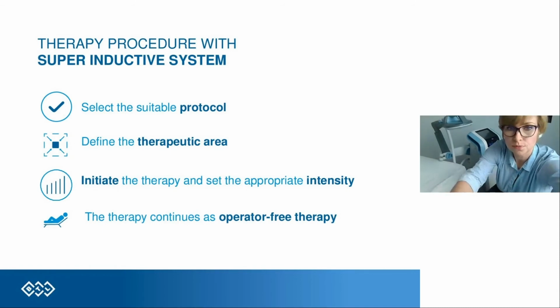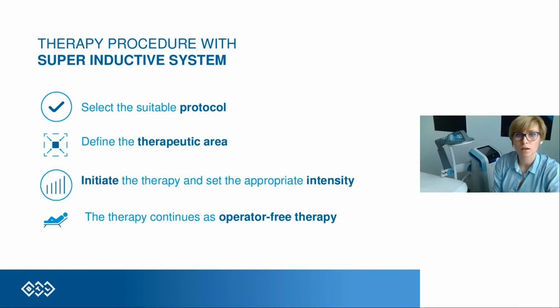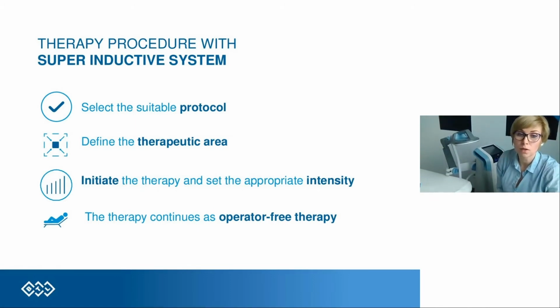So as I told you, this treatment is very easy. So we can use the suitable protocol. Of course, we can use the manual mode, and we can create our own protocols, and we can use the specific frequencies, modalities, and intensity modalities to create our own protocols. But also we can use the preset protocols, which are default in the device. So we define the therapeutic area.